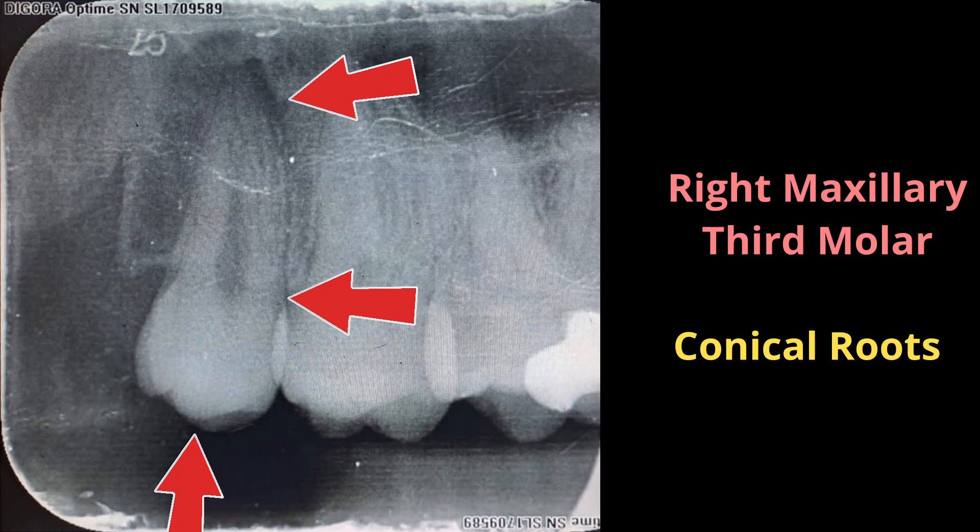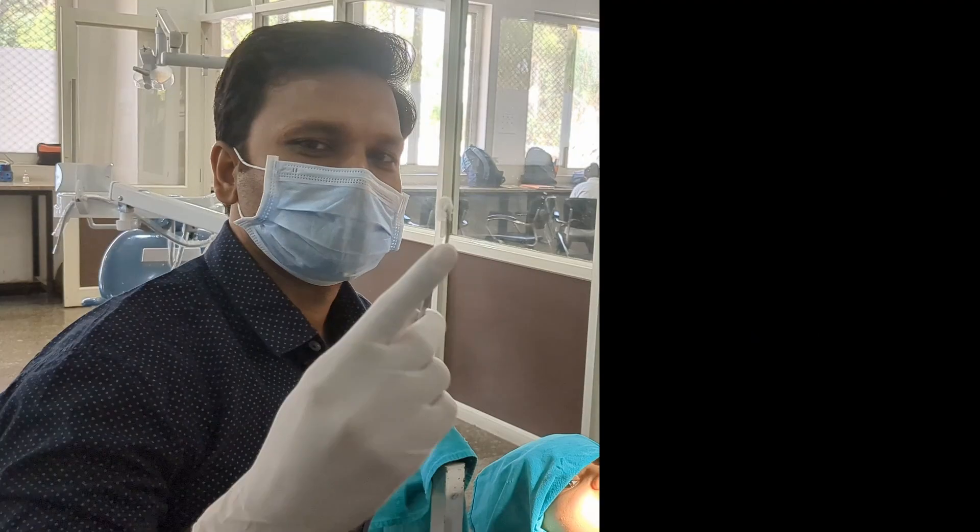Today I am going to show you the extraction of right maxillary third molar. It is going to be a simple and straightforward procedure as the tooth is completely erupted and has conical roots.